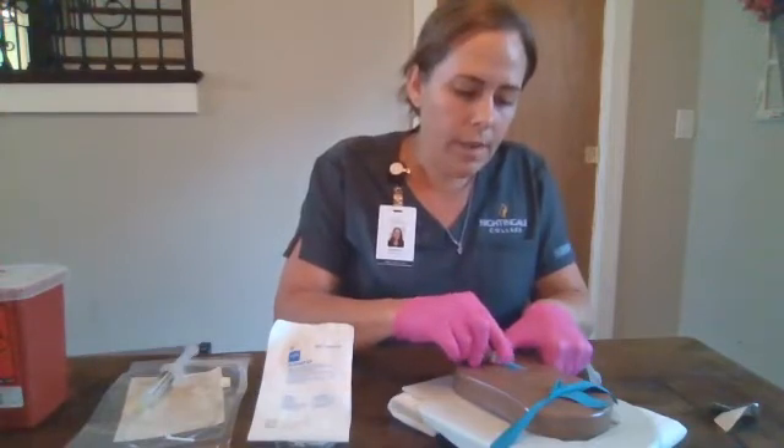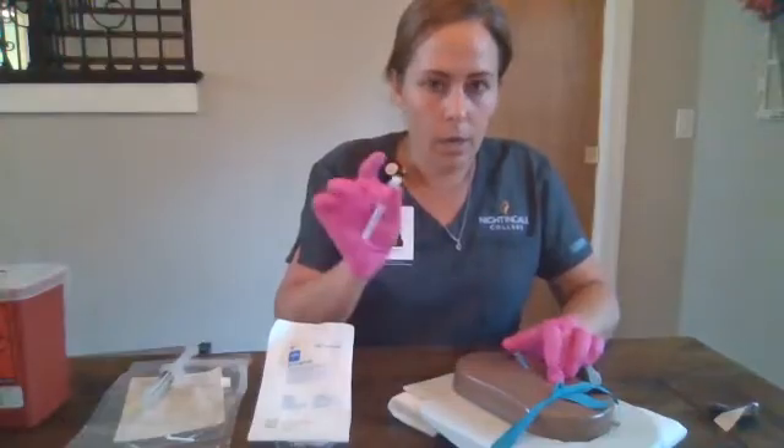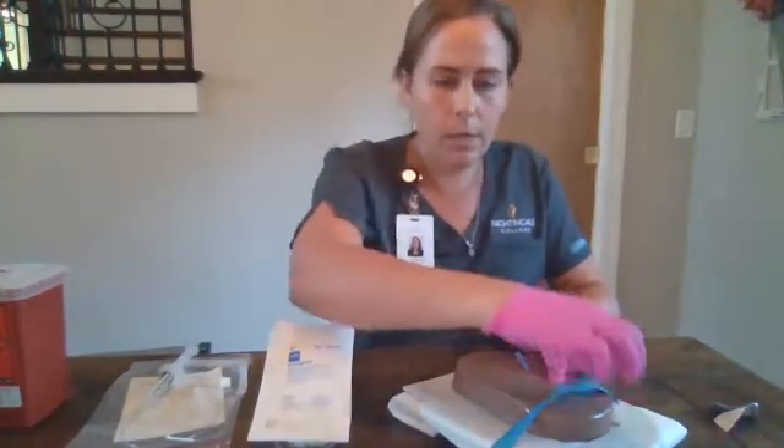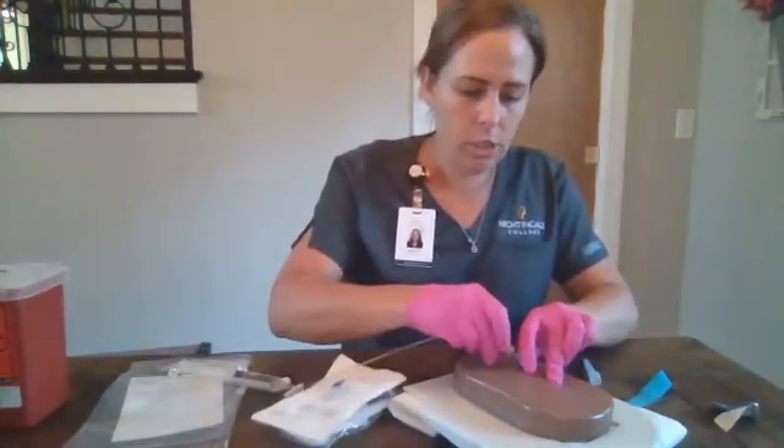We're going to feed our catheter off, tamponade, and release our needle. The needle goes into the sharps container, pop our tourniquet, and we're going to attach our extension tubing.